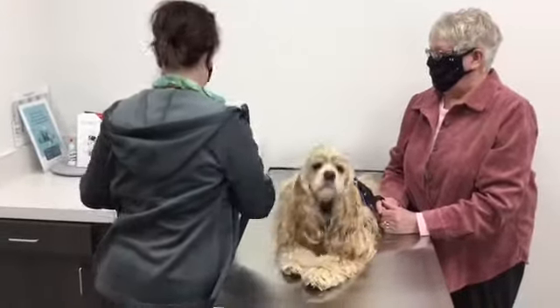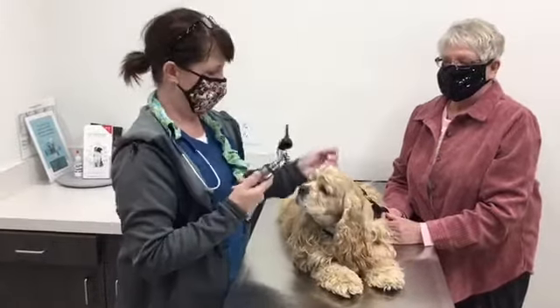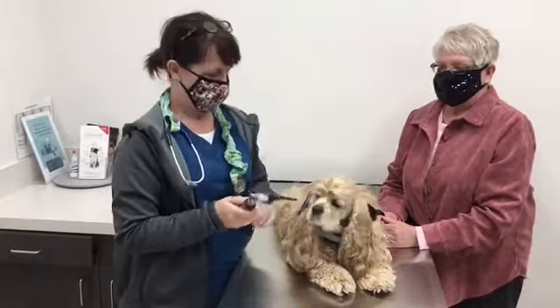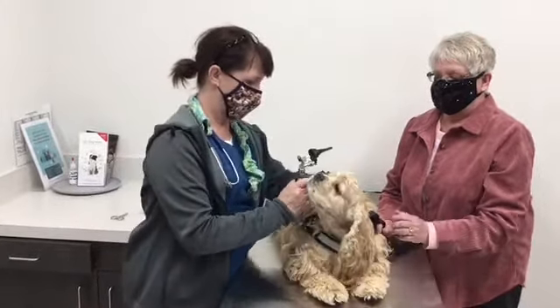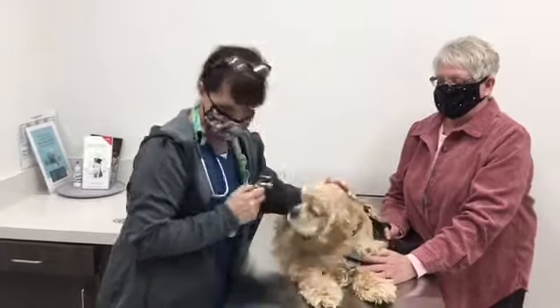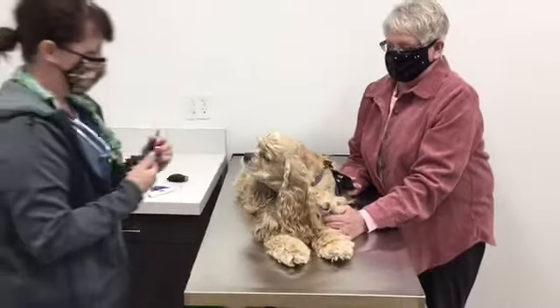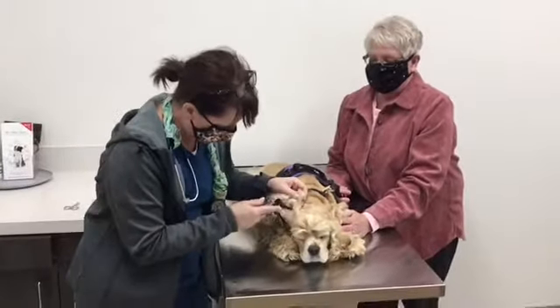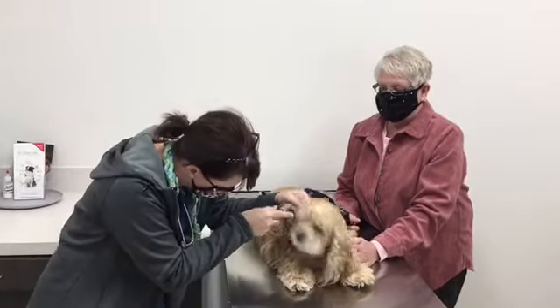Piece of lint. Then we can take an otoscope, and I can take this and look into her ears. And there's a little light on there, and I can look in her ear canal. I know, it tickles a little bit. So we take a look in her ear canal and make sure everything looks good.